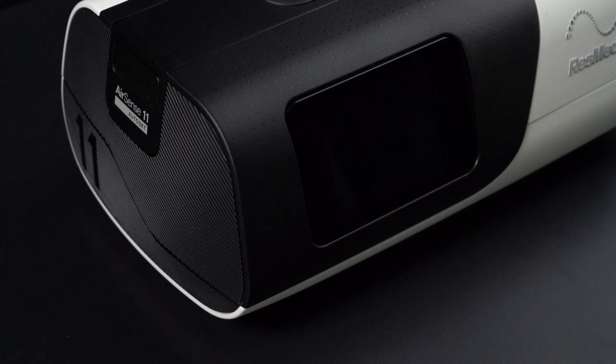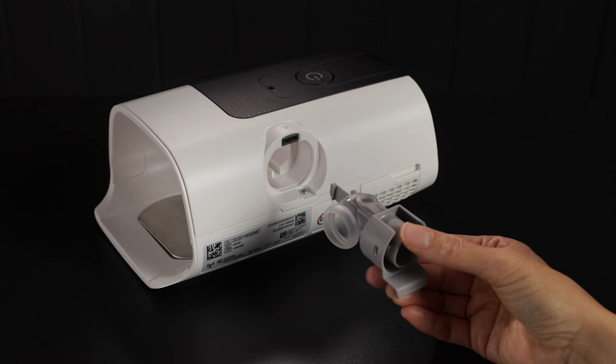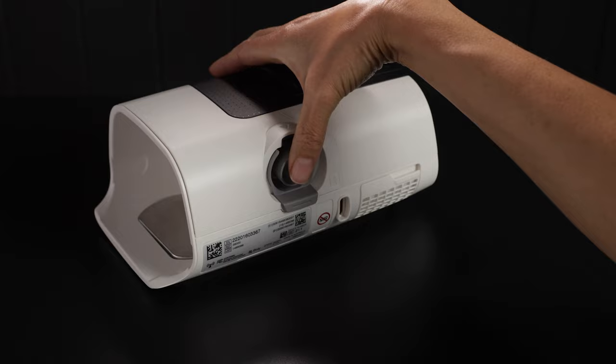Reassembling. When the humidifier tub, air tubing, and outlet connector are dry, you can reassemble the parts. To reassemble the AirSense 11 system, hold the outlet connector with the seal pointing to the left and the clip pointing forward. Make sure the outlet connector is correctly aligned and insert the outlet connector into the socket. Check the outlet connector is inserted correctly.